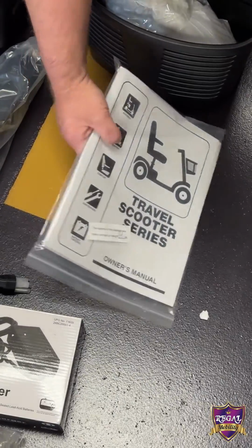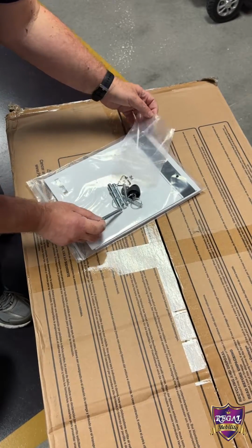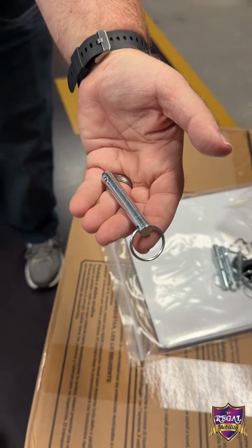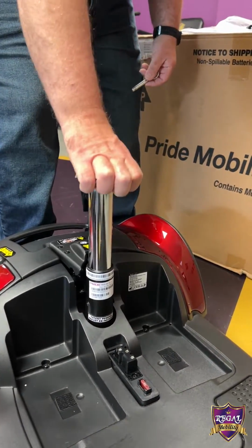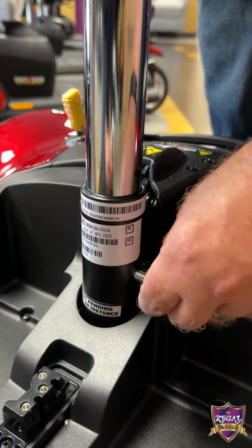First step, grab both the metal post and the bag for the owner's manual. Go ahead and retrieve one of the larger metal pins from out of the bag. Now, insert the metal post into the seat post hole near the rear of the scooter. Use the metal pin to secure the seat post into place.